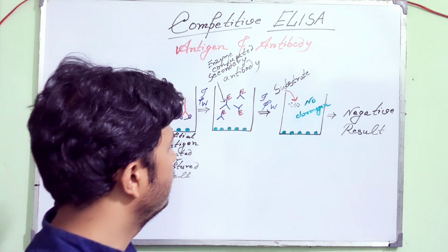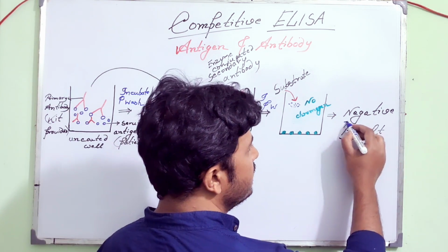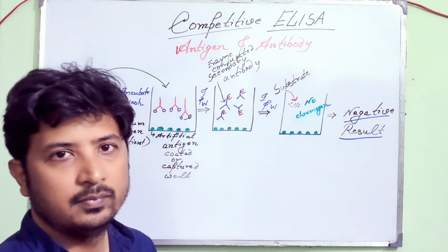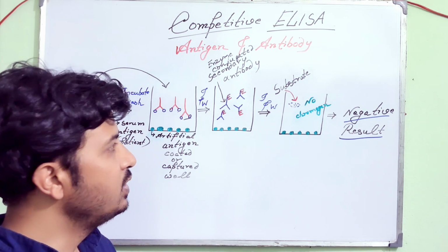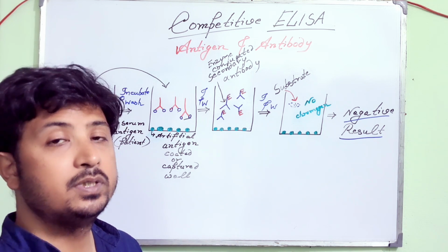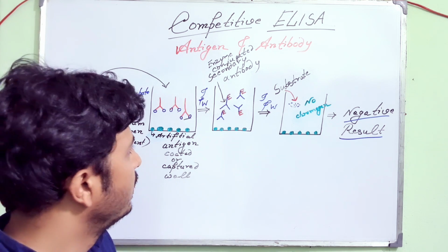So a negative result, does it mean the patient is negative? Does it say the patient is negative? No. A visually negative result gives you a positive patient. That is the beauty of competitive ELISA.